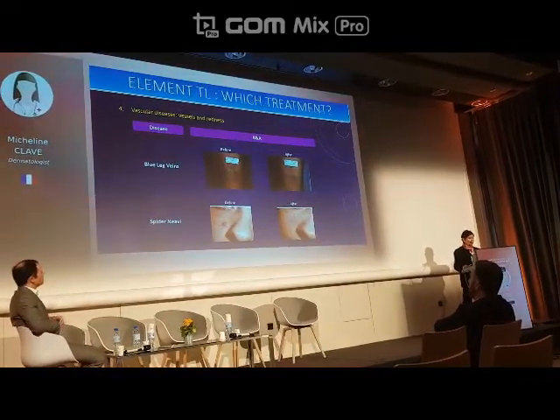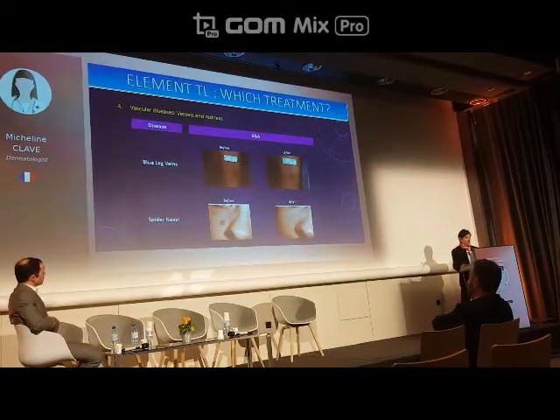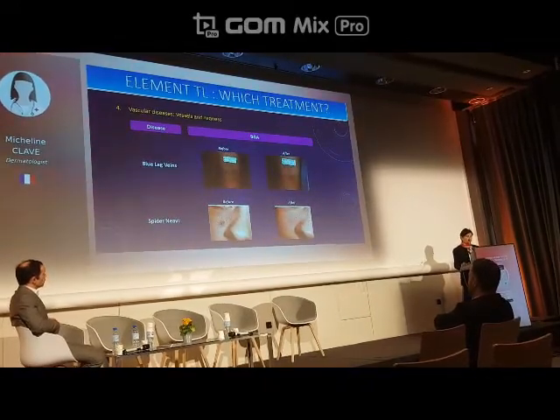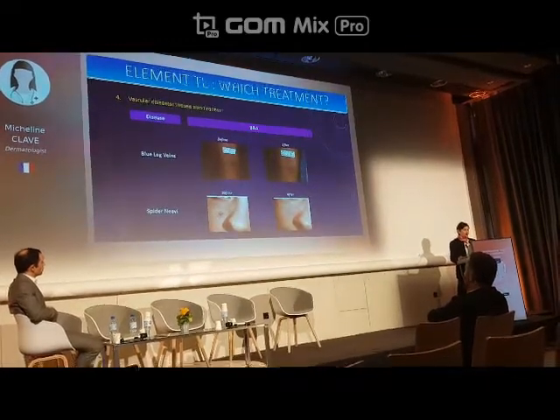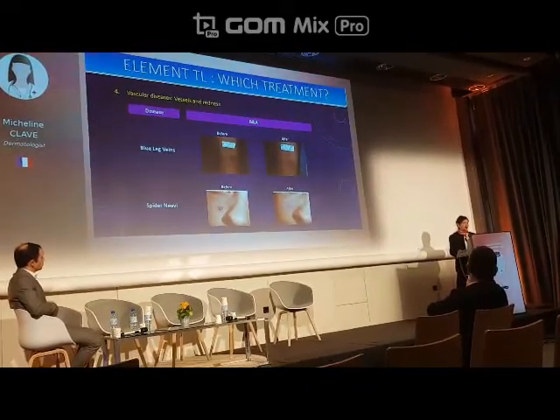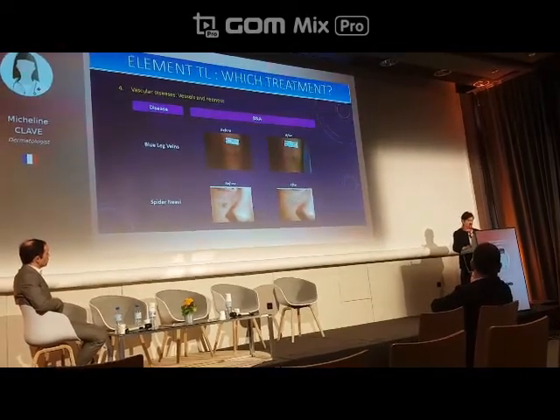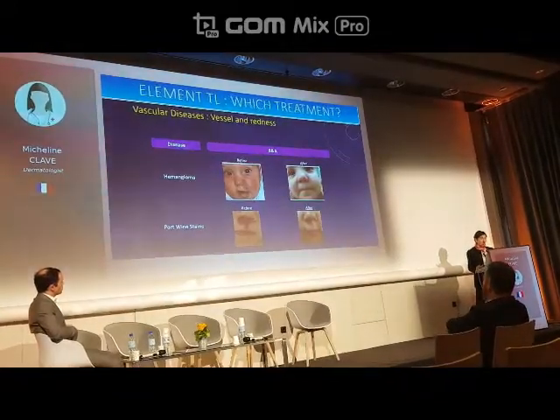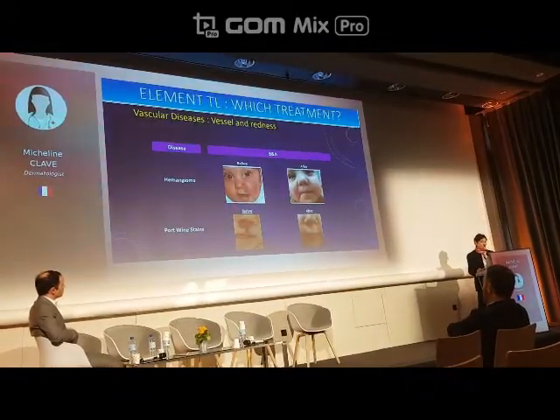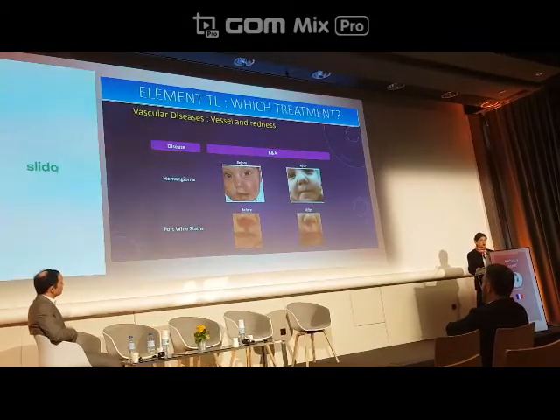Example of a blue leg vein on the leg treated with Nd:YAG laser, and a spider nevus on the face with Nd:YAG laser also. Hemangioma and port-wine stains in the baby, and the face of the baby treated with KTP laser.